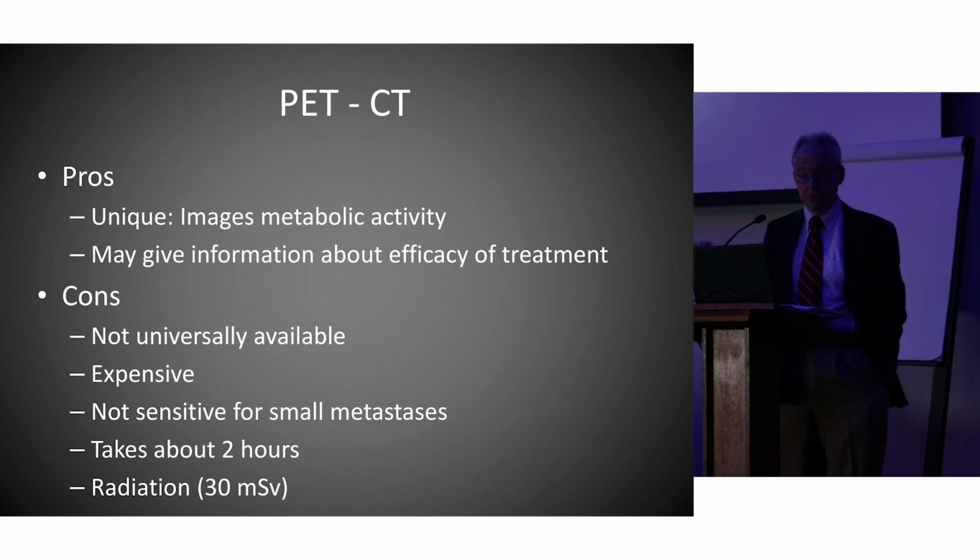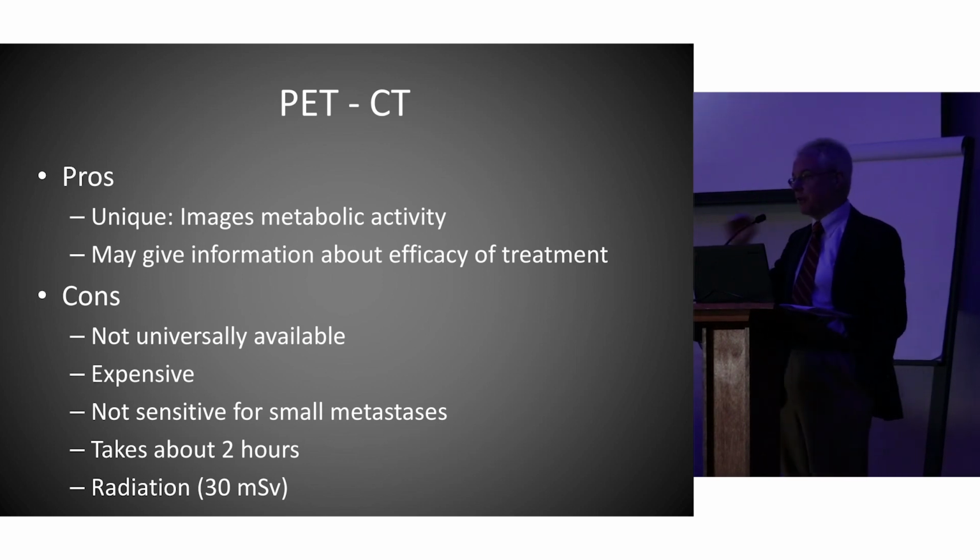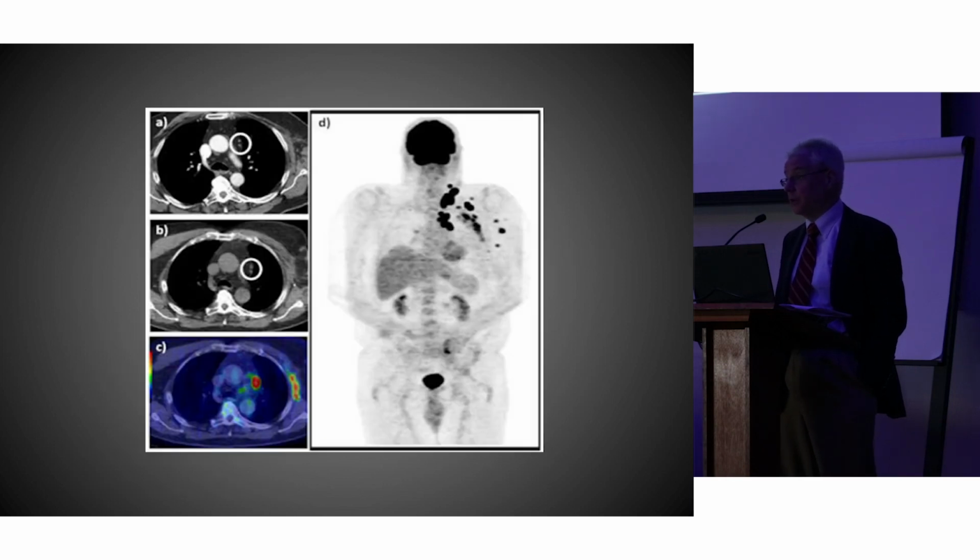It's expensive. Every imaging center doesn't have a PET scan. It's not sensitive for very small tumors. There's usually a threshold of about 1 centimeter, and tumors under that size will often be missed. A lot of radiation, and takes about 2 hours. So we certainly don't feel it's reasonable to use this for a screening tool.